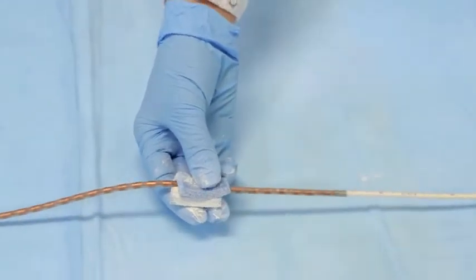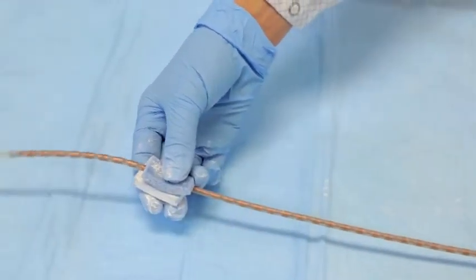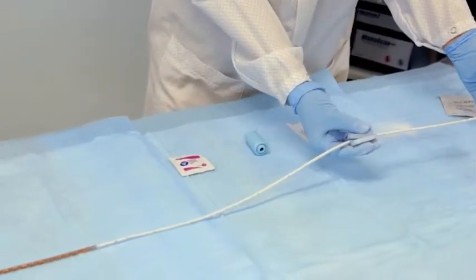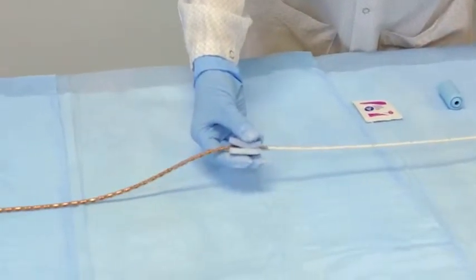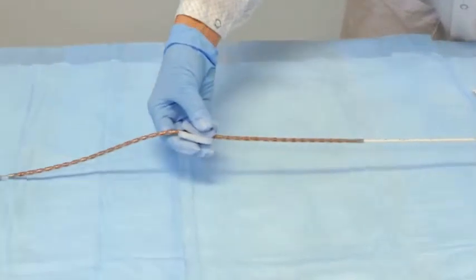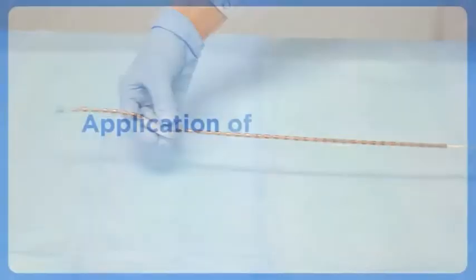Do not allow the catheter to touch the floor or other surfaces. The goal is to apply a light, even coating of talc along the entire length of the catheter.